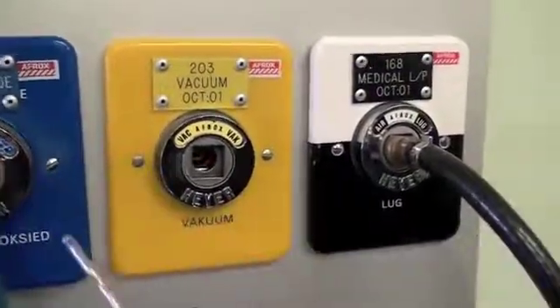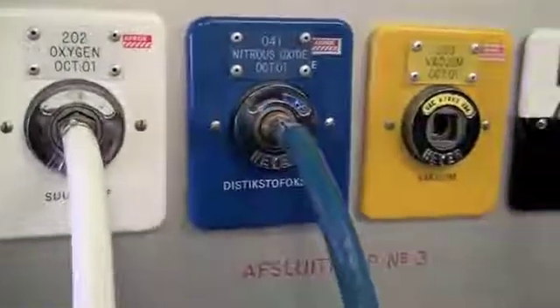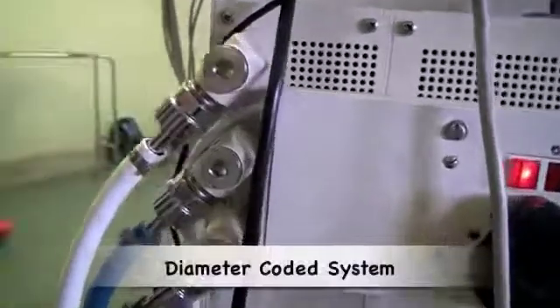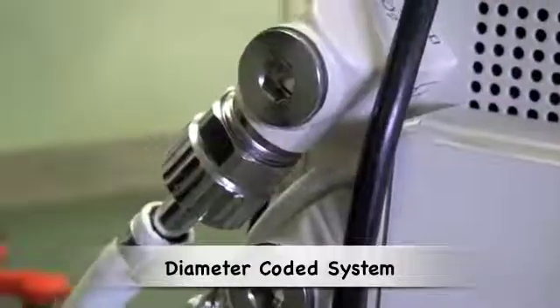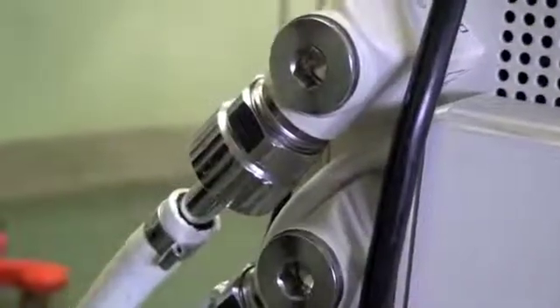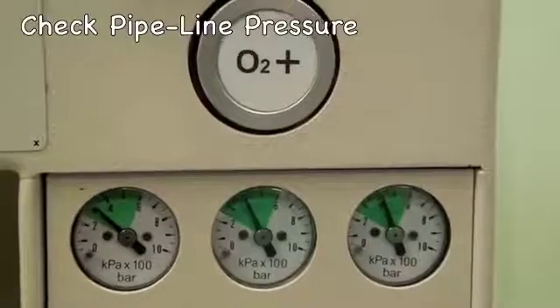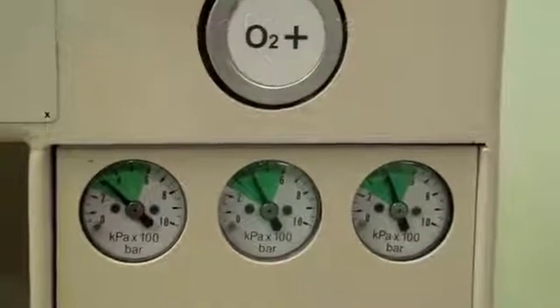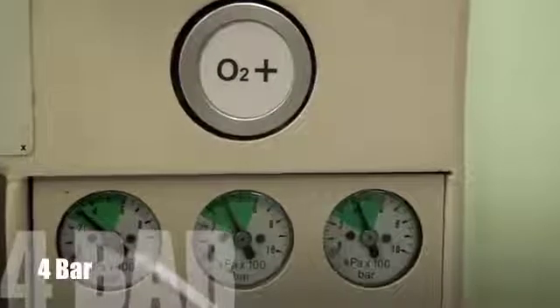The colour coding at the wall corresponds with the colour coding of the pipeline to the machine. At the back of the anaesthetic machine, where the gas enters, there is a diameter-coded system so that only a specific gas can be connected to each port. One then checks the pipeline pressures of each gas on the front of the machine; each one should be around 400 kPa.